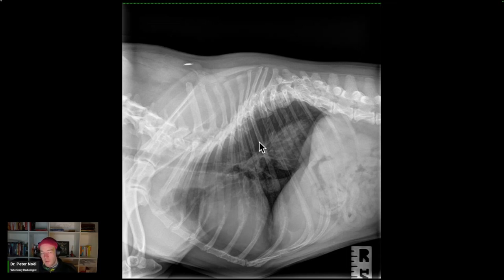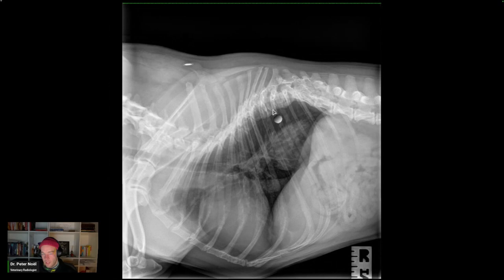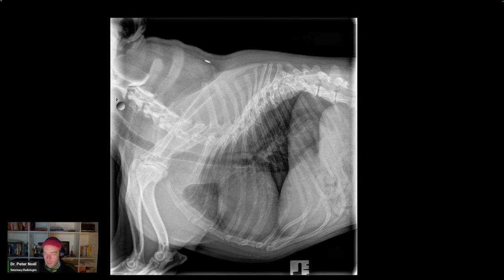And I would say that there are numerous thoracic vertebral body anomalies characteristic of the breed. The vertebral body anomalies contribute to a caudal thoracic kyphosis and scoliosis. And then you could talk about spondylosis deformans in here. But to go on about the disc spaces, that's not helpful. What could be helpful is if you say that the last ribs are symmetric, because this dog may have surgery at some point in his life, and that can just be something that's useful to document, but not necessary. So I would describe it as numerous thoracic vertebral body anomalies characteristic of the breed, contributing to a caudal thoracic kyphosis and scoliosis.